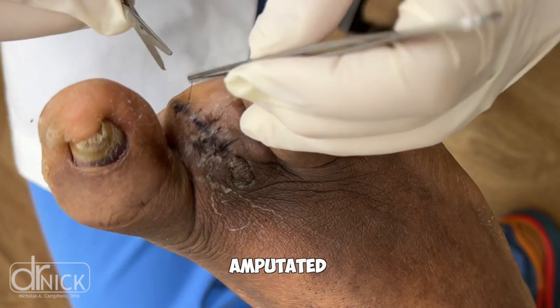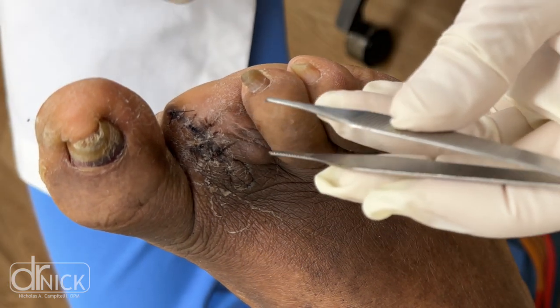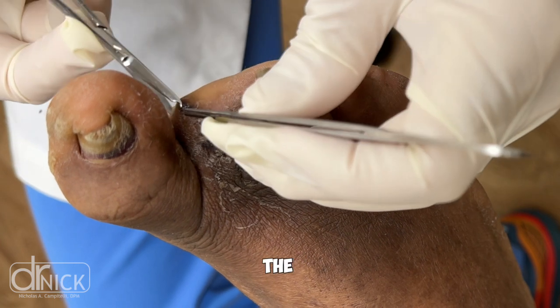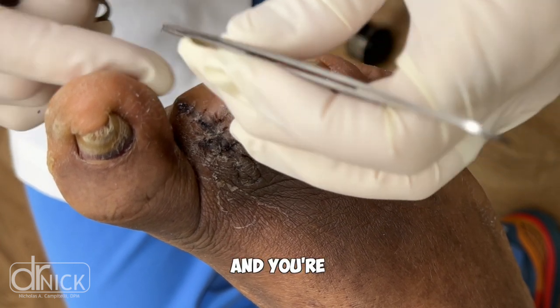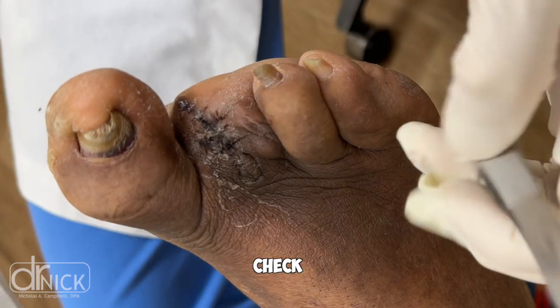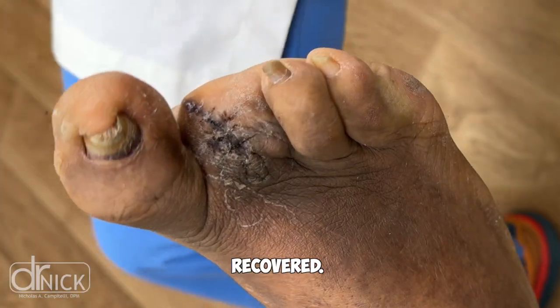Within a week of having the toe amputated, the patient's blood sugars went back to normal. We're looking at a period now that's about 14 days after the surgery. We remove the stitches, and you're going to be able to see here after these stitches came out — we double check our incision, everything is healed, and the patient is going to go back into a shoe and they're recovered.